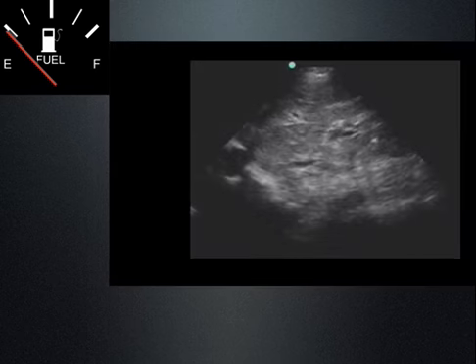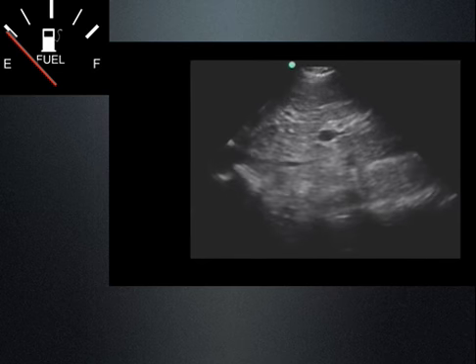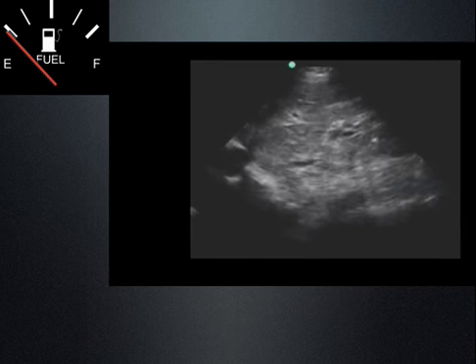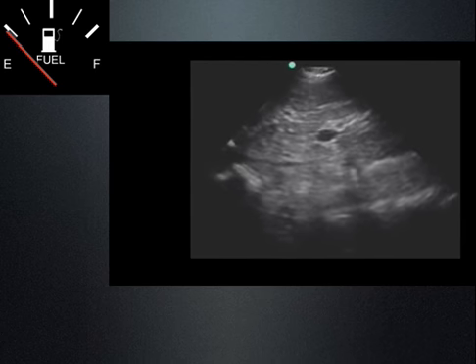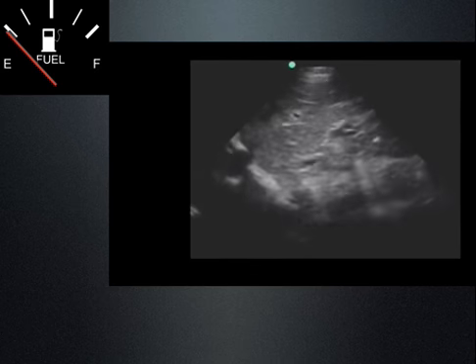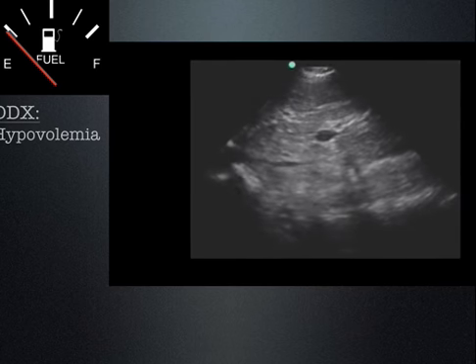Very low intraluminal pressures. And this one, if you're not looking carefully, you'll miss it. There's the vena cava right there. Very small, low tank. What do we know just from this image? Imagine that patient sitting before you. Blood pressure is 80 systolic, diaphoretic. You can't get any history out of them. You put the probe on there. What do you get just from this image?